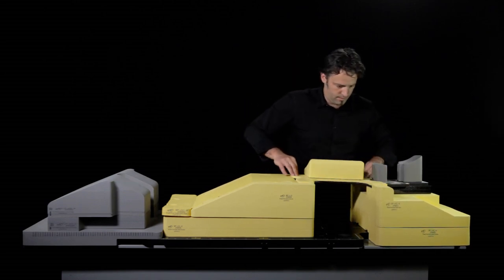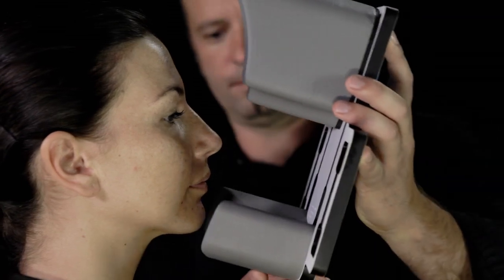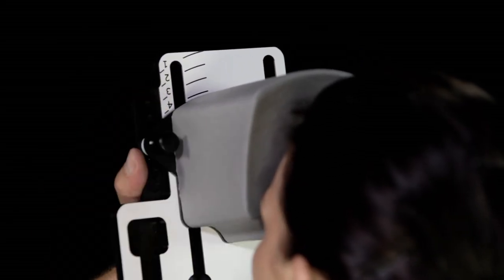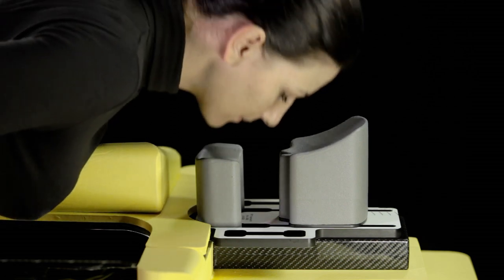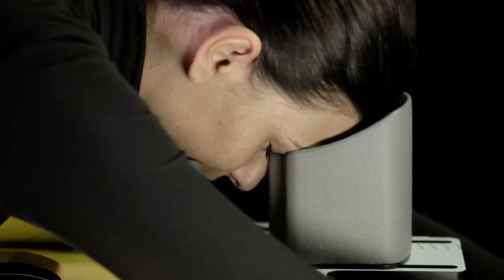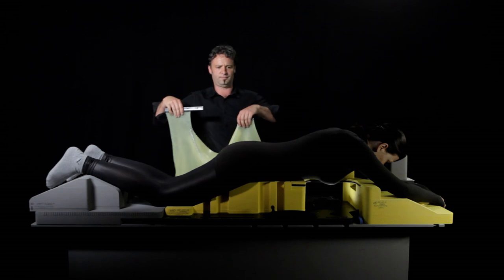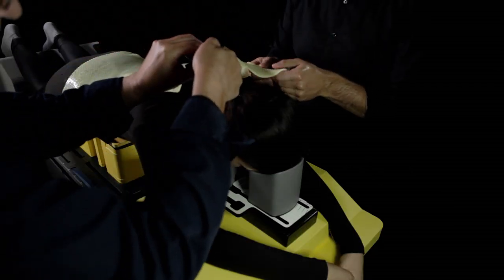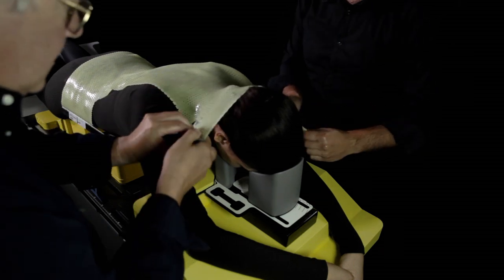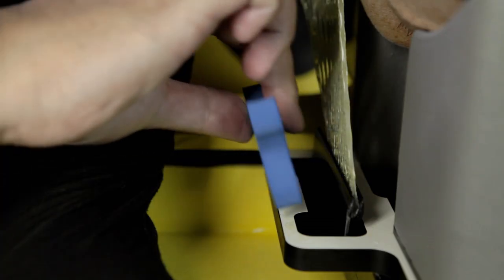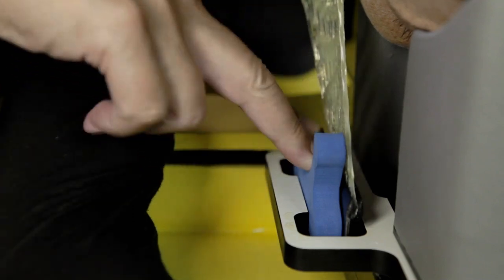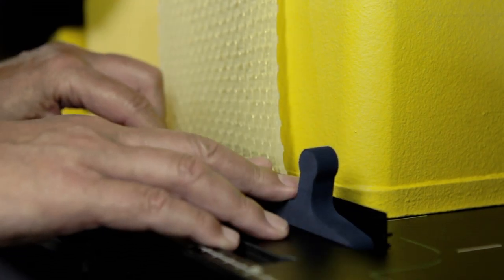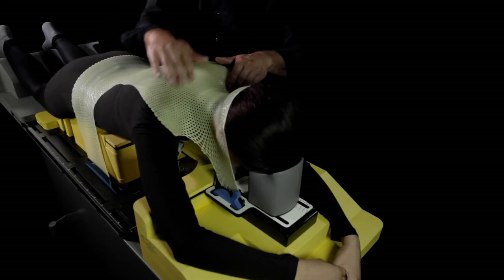Position the bridge plate so that the gap is at the side of the breast to be treated. Before the patient lies down, adjust the size of the head support so that the chin and the bridge of the patient's nose fit into the head support. In order to increase the precision of treatment, a thermoplastic mask can be used. This mask clips into the channels on the base plate of the head support and in the wide grooves just behind the tunnel between the two base cushions. Fix the clips of the mask using the blue EVA blocks. Ensure that the mask fits snugly around the patient's shoulders.